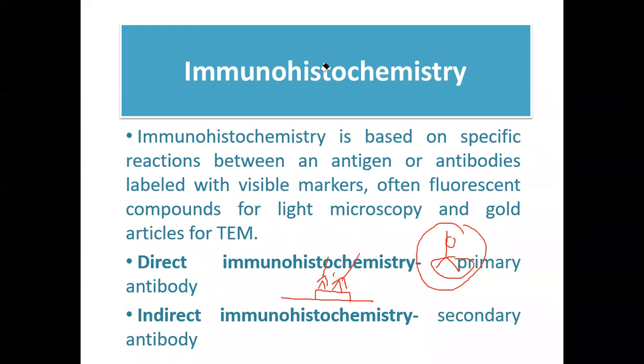Okay? Hold on. Yan. So pwedeng kakabit yung isa diyan. So this is the fragment antigen binding. Okay? So, kakabit siya dyan. Pwedeng another din, kakabit isa dyan. Okay? Pwedeng another ulit, dito ulit. Kakabit ulit yung isa dyan. Kasi directed sila against these antigens. Okay? So, guys, labeled sila, right?